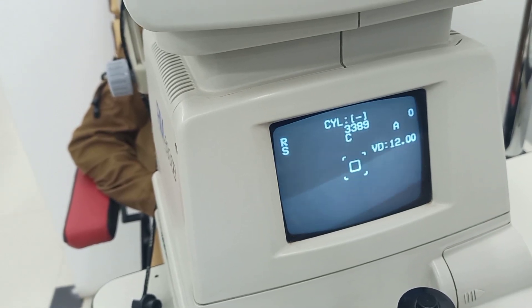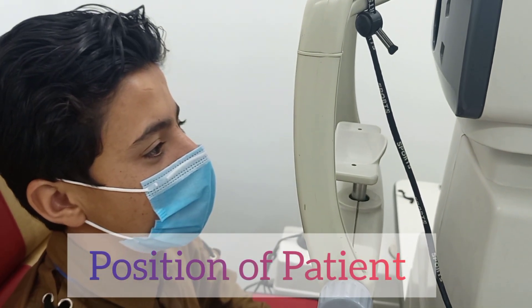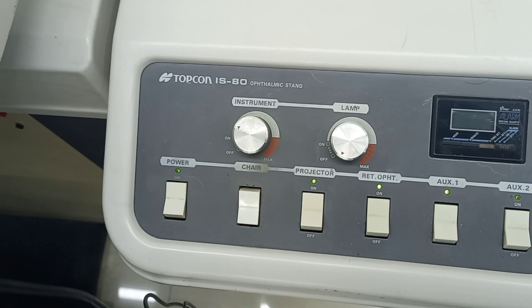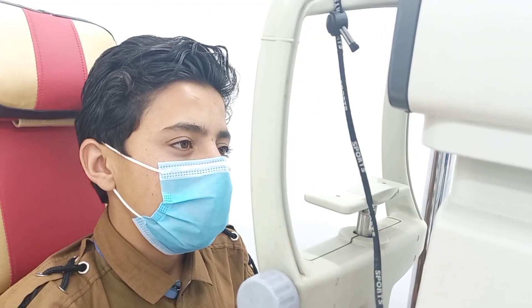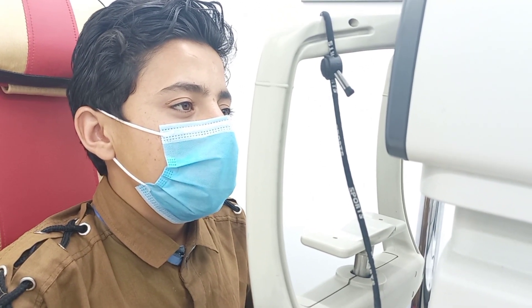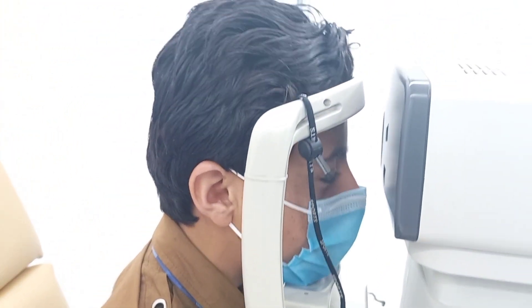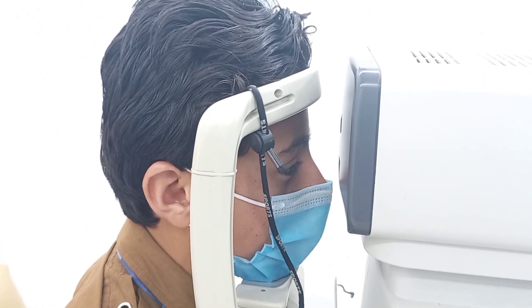The position of the patient is very important. As you can see, the patient is unable to reach the chin rest, so we have to elevate the chair. The patient should put their chin on the chin rest and touch their forehead — this is the proper position on the auto refractometer.